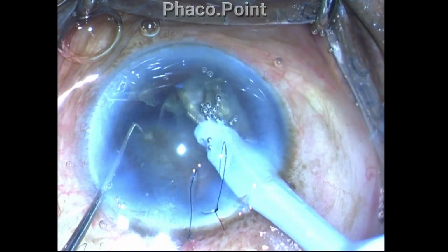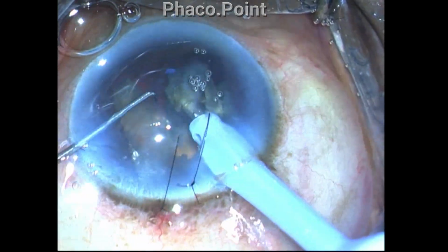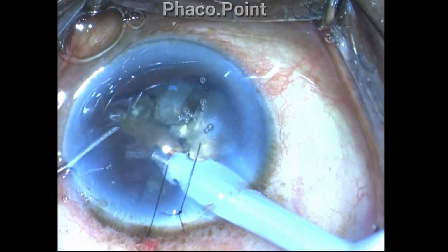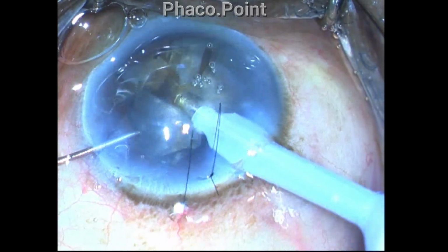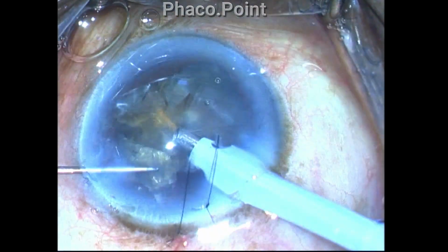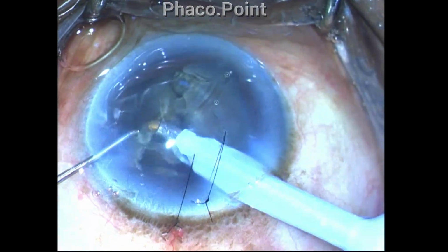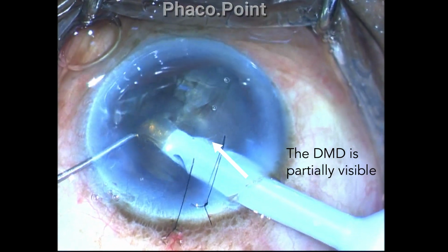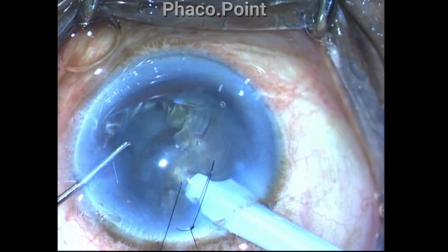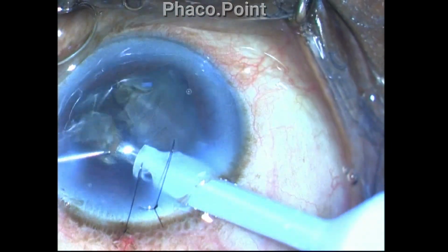So I am able to relax a little and continue with phaco emulsification and concentrate on the process of nucleus disassembly, and I am able to slowly eat away the nuclear fragments. A little bit of iris chafing occurs, but this iris is not going to keep coming into the phaco probe because it is stretched with the pupil dilating device. It doesn't bother me so much at this point. So with very great caution, applying small and short bursts of ultrasonic energy, I am able to emulsify these fragments slowly.